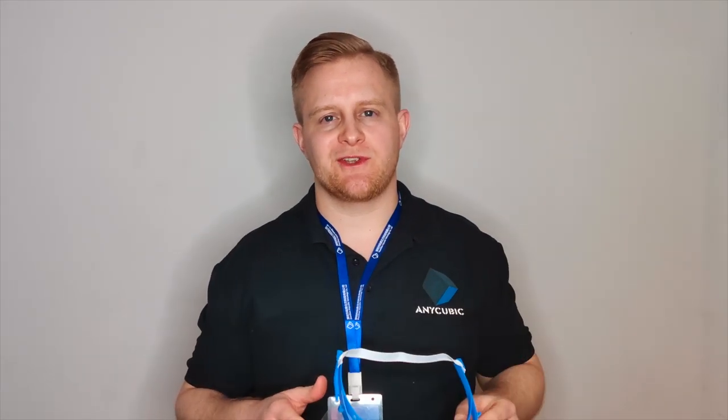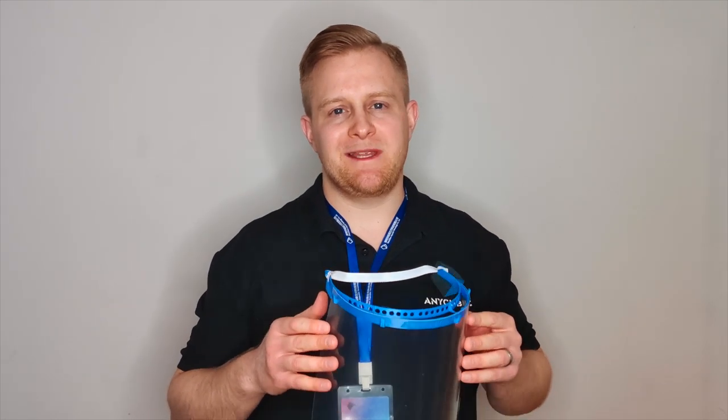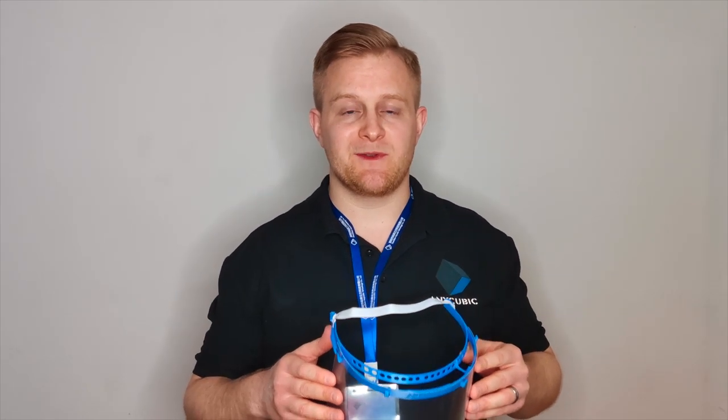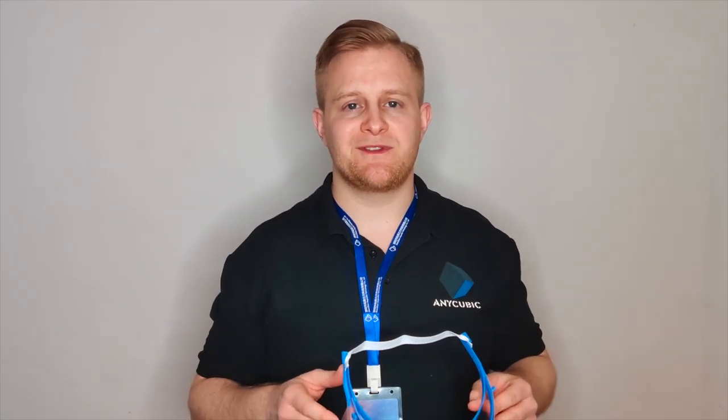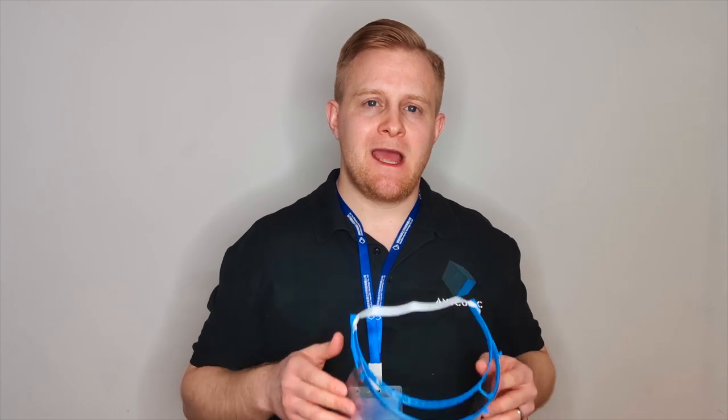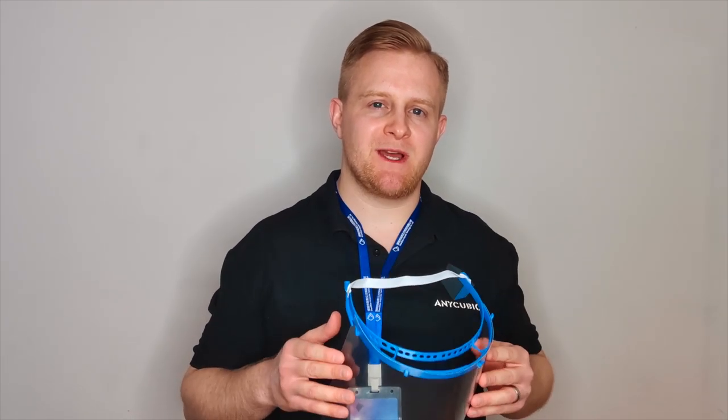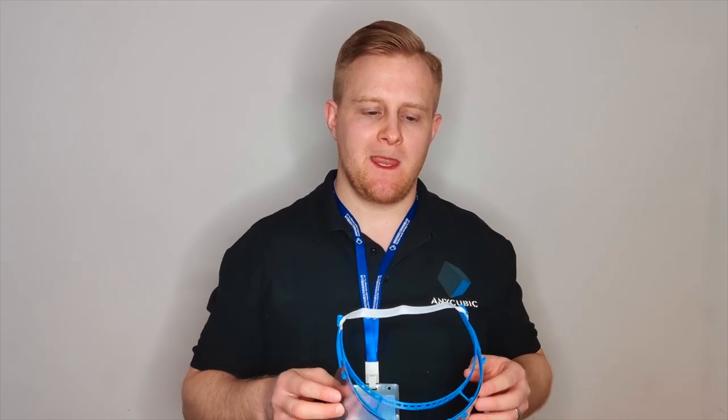We've designed this face shield in collaboration with Eric Pleschke, a German mechanical engineer. This face shield can easily be printed with one of our 3D printers or any other 3D printer that you maybe have at home. Today I'm going to show you how you can make this face shield by yourself.